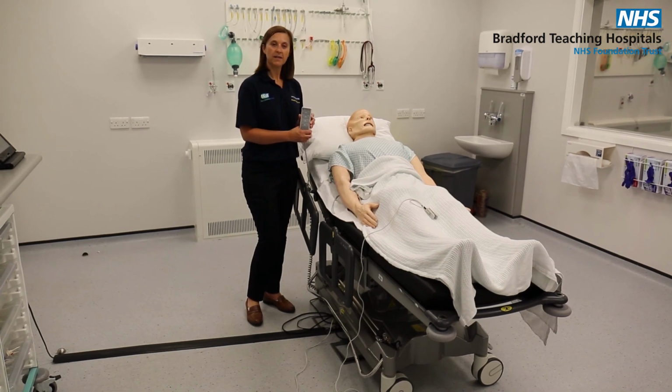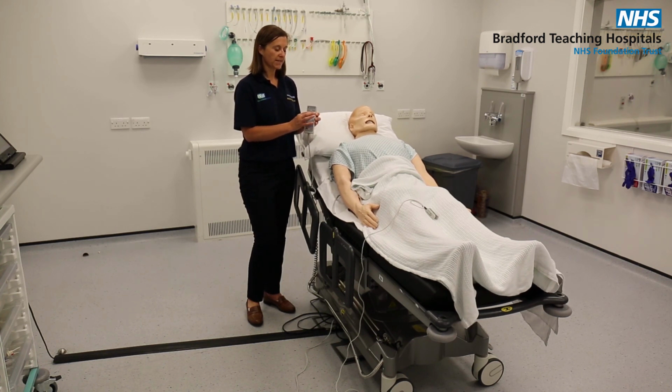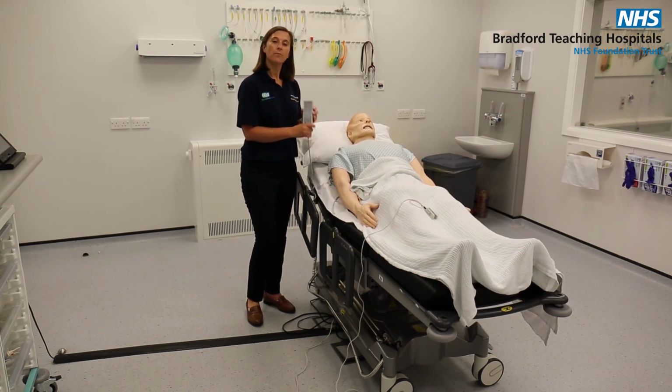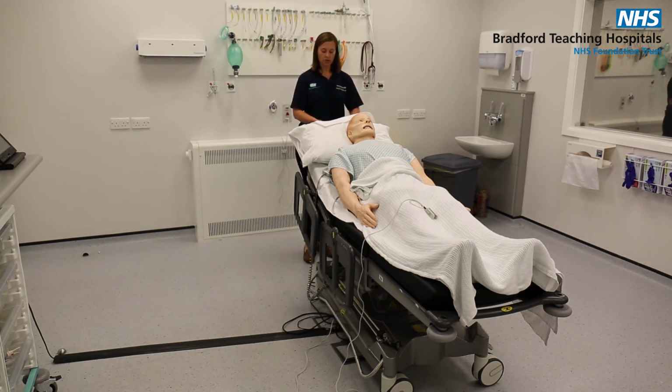So to move Simman, it's easier to move him on the trolley. So the trolley will sit him up or lying down as necessary. Please don't try to move Simman yourself. He is incredibly heavy and you're more likely to do yourself damage than actually move him effectively. Try not to use the yellow handle at the top of the bed, as this does not sit the trolley up or lying down. What it does is it drops the head of the trolley off.